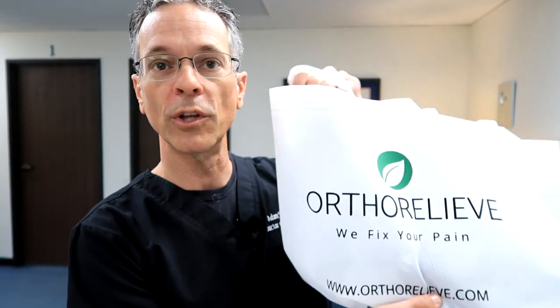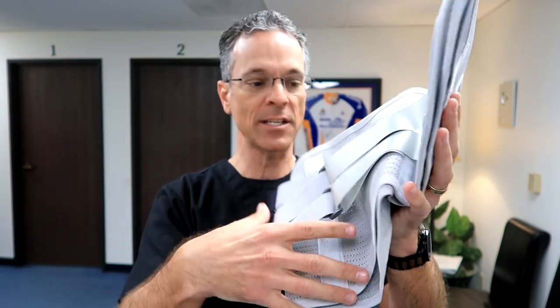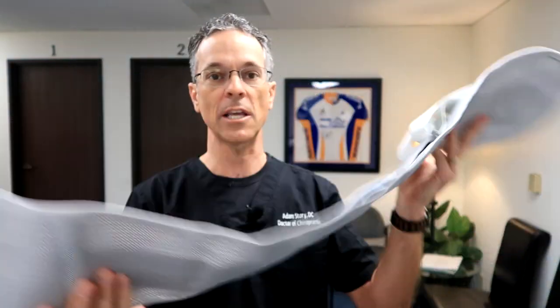The back brace that I like to use is a brand from Ortho Relieve. Let me show you what's in here. There are different pads, but I'm going to show you how to use these and, most importantly, what to look for. This is called the Lumbar Mate, and it is specifically for the types of back pain that I normally see.